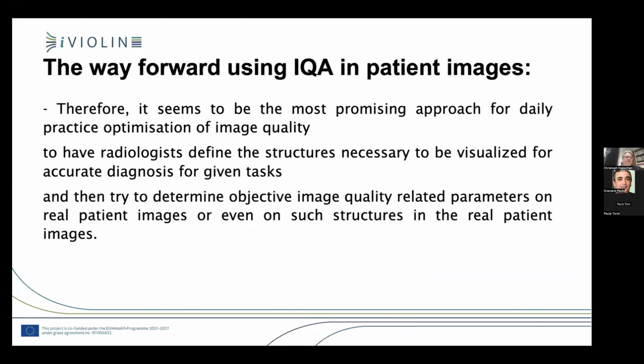So therefore, I want to end my talk today by looking forward with you at using IQA in patient images. It seems to be the most promising approach to me, and that was also what was done in i-Violin so far, for daily practice optimization of image quality. So we no longer look into the systems, we really look into patient images.